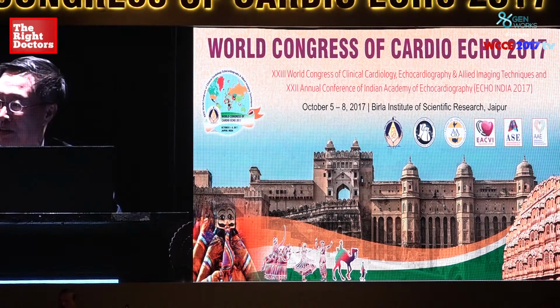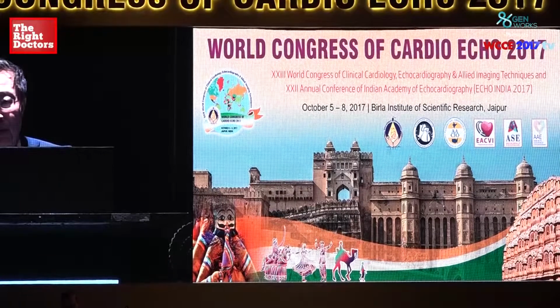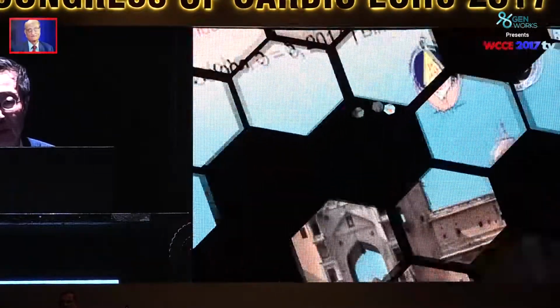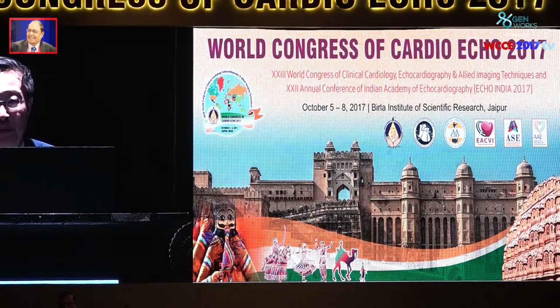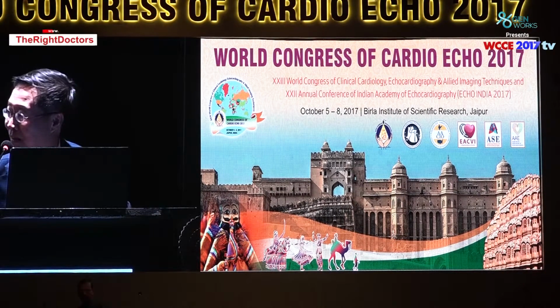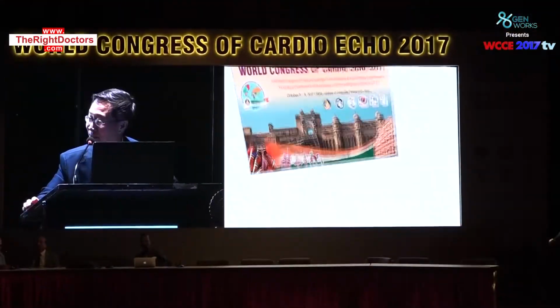We can go on and on with multiple things, but I think that just using those four parameters first, you should be able to assess diastolic dysfunction in the majority of patients. But in patients with bundle branch block, pacemakers, mitral annulus calcification, prosthesis and hypertrophic cardiomyopathy, those patients need further help. And Dr. Klein will tell you about the other important parameters for the veins and the IVRTs. Thank you very much for listening.